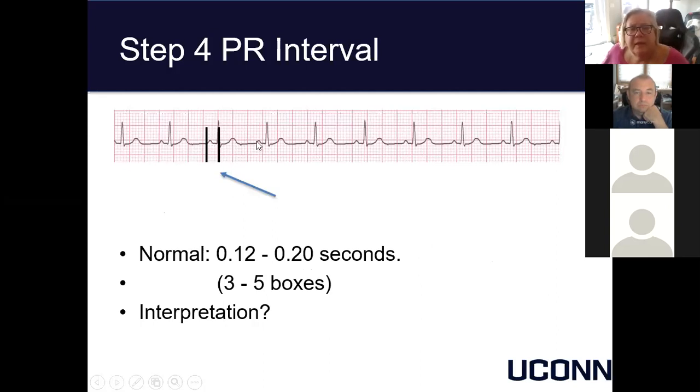Again, measuring the PR interval is important from a first degree or normal sinus rhythm perspective when you have a normal, regular P wave. You still need to know that PR interval before you can call it a normal sinus rhythm.